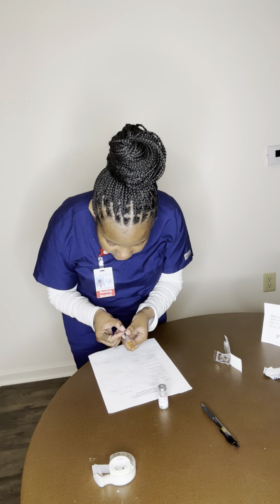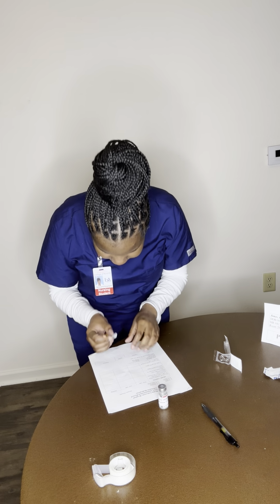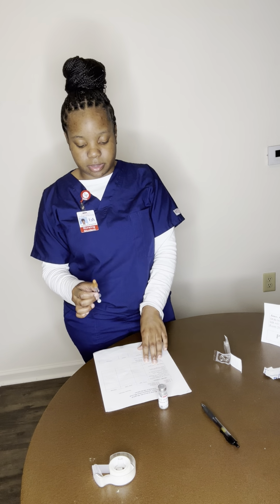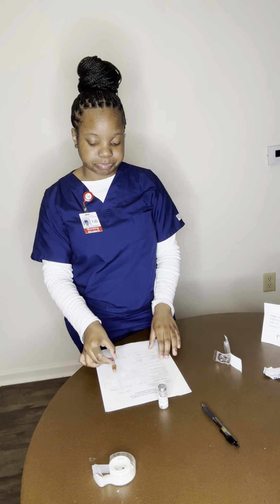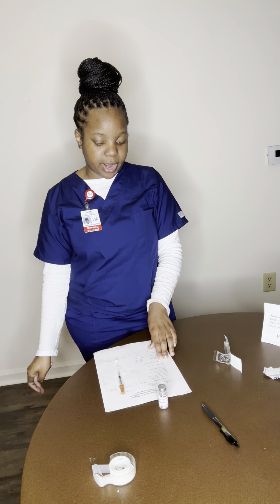And I do have 0.5 milliliters in my syringe. So now I am going to move on. Normally I would have another nurse check my calculations and verify that I have enough solution in my syringe. So now I'm going to move on to the right time.